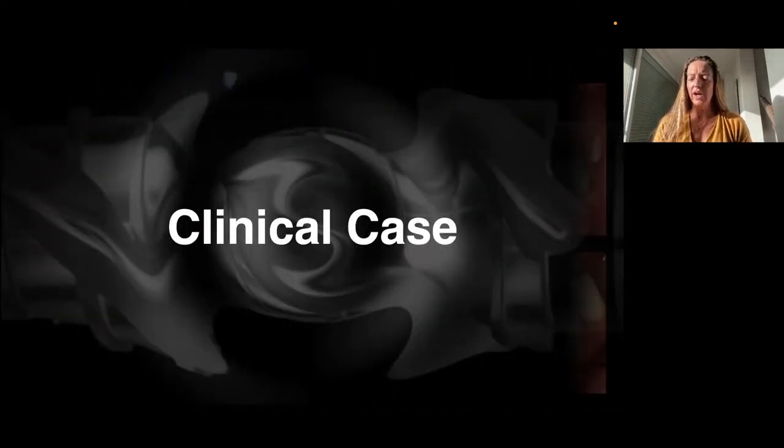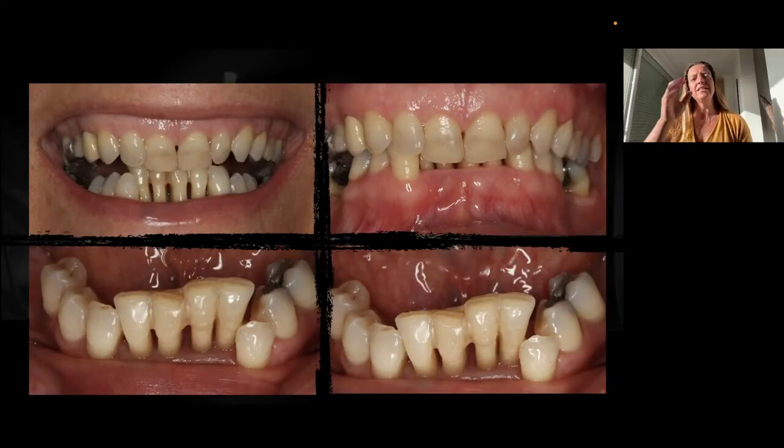Now let's go to another clinical case. This is a clinical case where you can see again exactly where the problem is. Now the problem is in the 4 incisors, not the upper ones, but the lower ones. So we had here a patient that had periodontitis, and the lower incisors have over-erupted. So they had mobility, they are already splinted to each other in order to try to maintain them, but here they had a very bad prognosis.